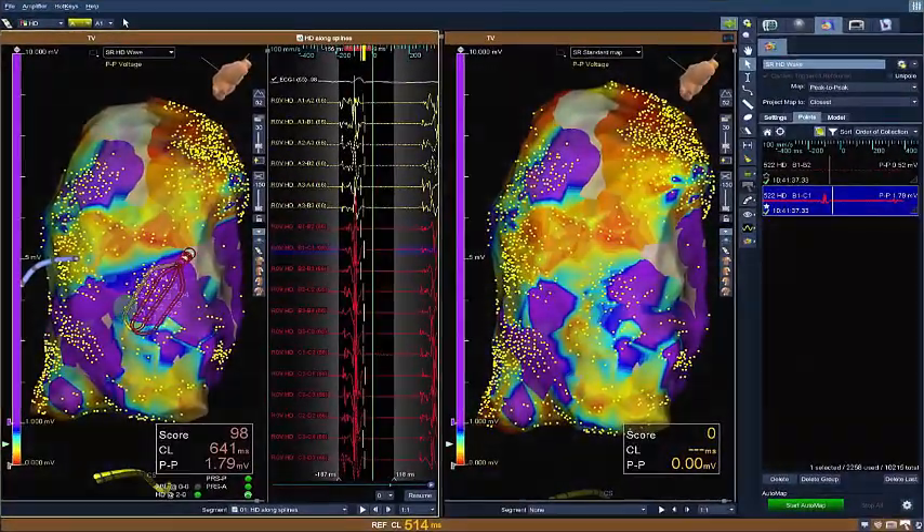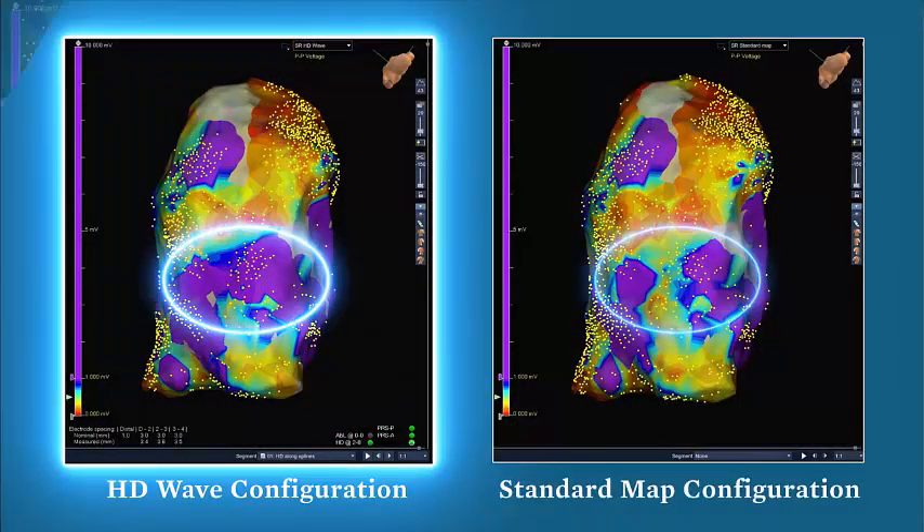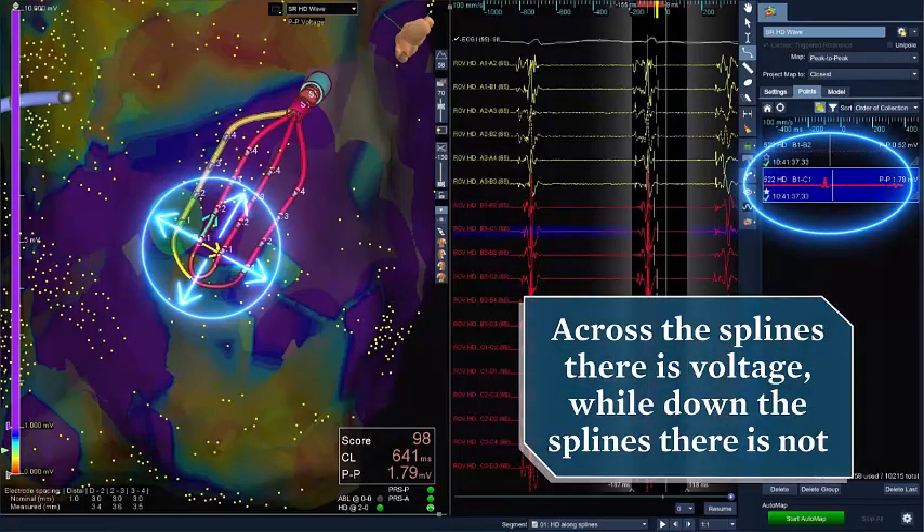Better identify areas of scar with HD Wave technology. The new grid configuration captures data in both directions compared to standard linear mapping — across the splines there is voltage, while down the splines there is not.